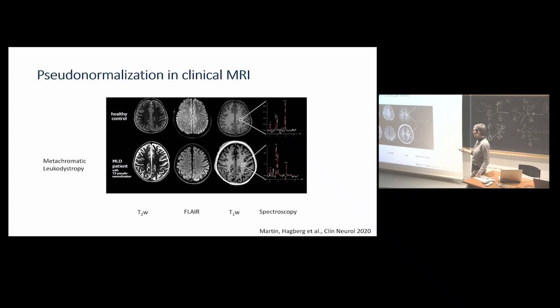But after some time, you cannot really see a good clinical effect anymore. So we should have seen some bright spots here in the middle, and we don't.